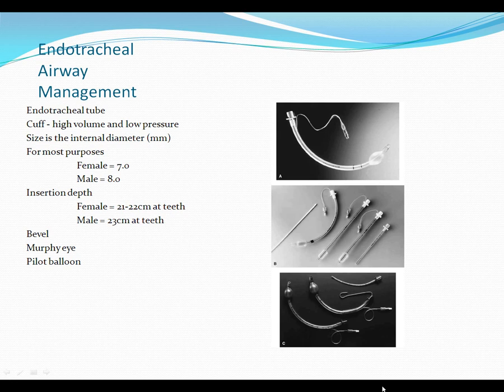That doesn't mean that you don't have to listen to breath sounds and everything. It's no guarantee. And then, same with anatomy, I think it's useful when you're talking about parts of the equipment to use the proper name.